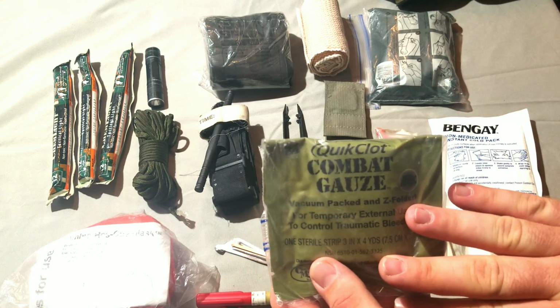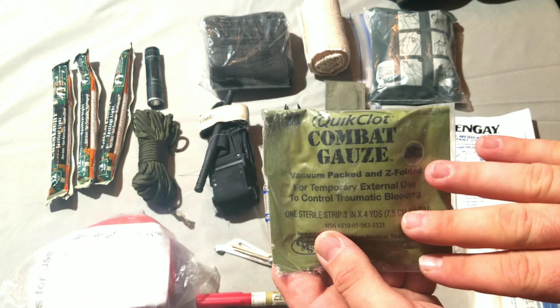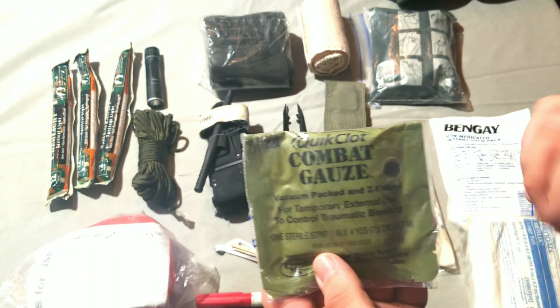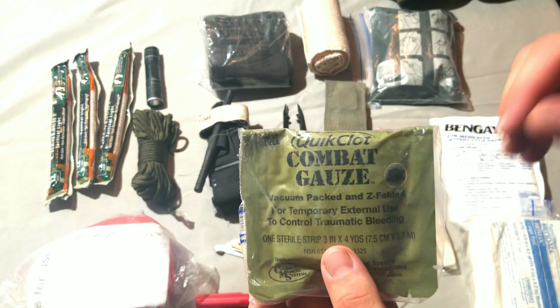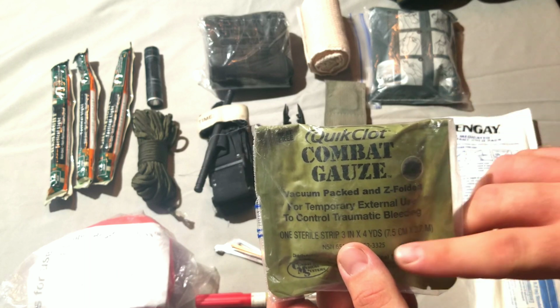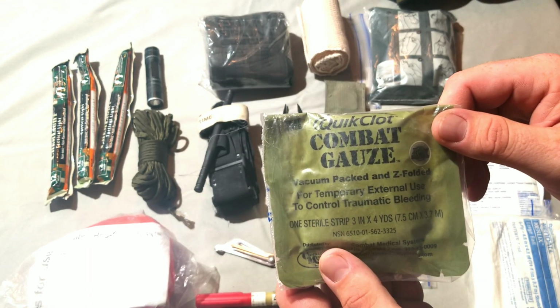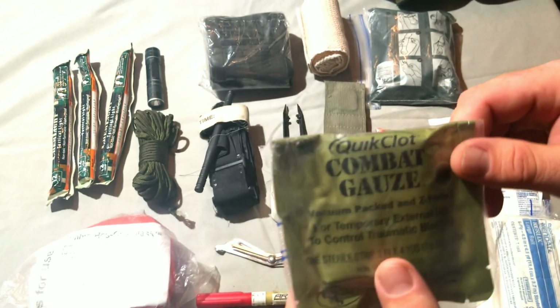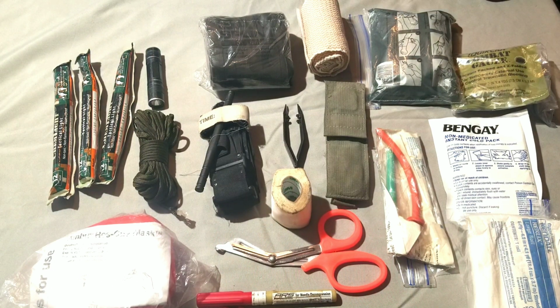But this is one of those things that if you're inserting this, it's going to take a surgeon to be able to get it out, because once it adheres to whatever it is that's damaged, it pretty much hardens and it's there to stay. So keep that in mind when using that. If you pull up on a car accident, it's no big deal. In a SHTF type scenario, it's something to really think of, because if you don't get this out and reattach all the arteries and everything like that, whatever's below this, you're probably going to lose it. So something to keep in mind with that, but it's a really good item to have.